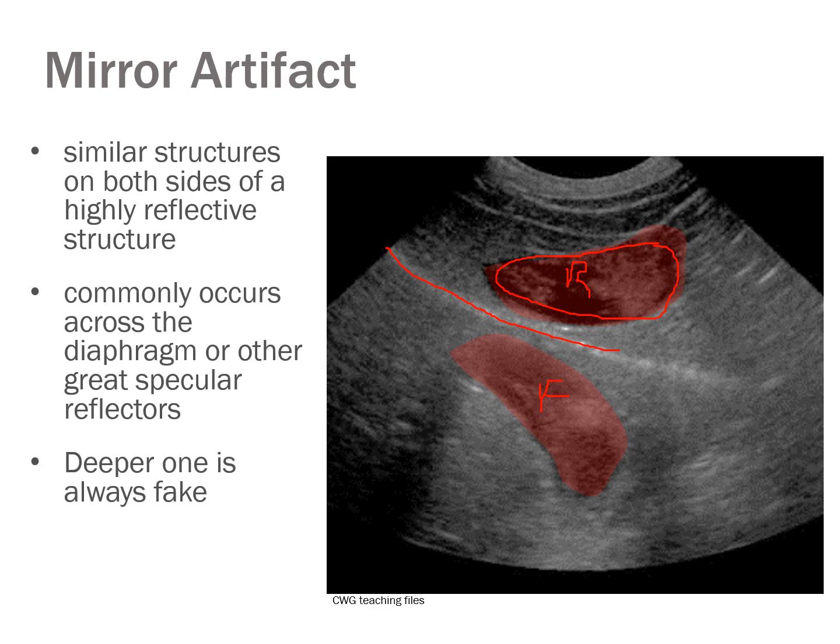The other thing that we oftentimes see is that we would see the liver reflecting past the diaphragm and up into the thorax. Well, clearly we know that there's no liver in the thorax, and this mirroring artifact is normal when there's not fluid in the lungs. However, if there's real fluid in the lungs, that mirroring artifact would get replaced with fluid and a posterior acoustic enhancement that would associate with it. And that would mean that the artifact that should normally be seen is no longer seen because there's real fluid in the way.